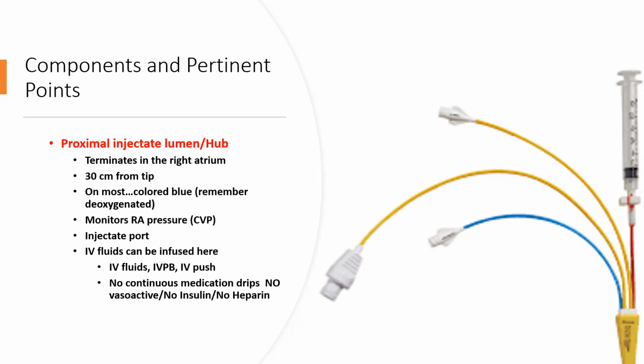Okay? So for those of you who have been doing cardiac output through the thermodilution method, you usually inject 10 mLs of fluid into this port. And therefore, you understand why you should never use this port to infuse vasoactive medications.